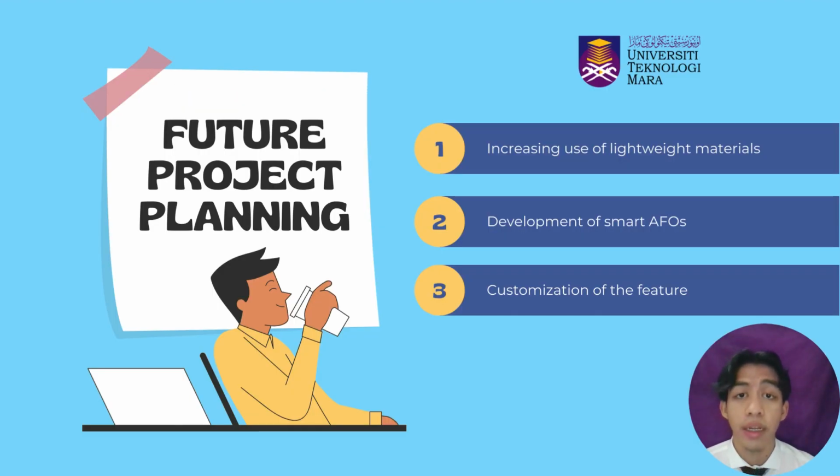There are several trends that are likely to shape the future of AFO. The first is increasing use of lightweight materials. AFO are likely to become lighter and more comfortable to wear as manufacturers continue to use lightweight materials such as carbon fiber and advanced polymers.